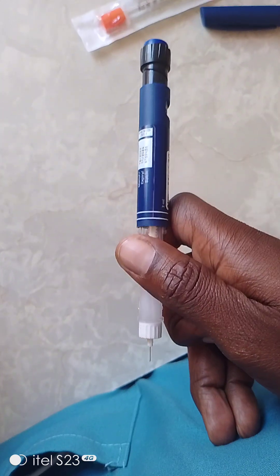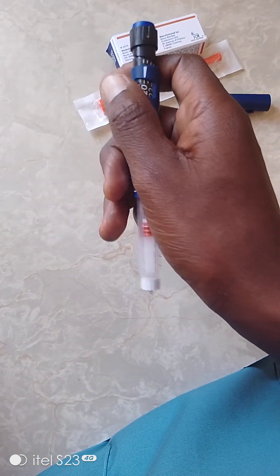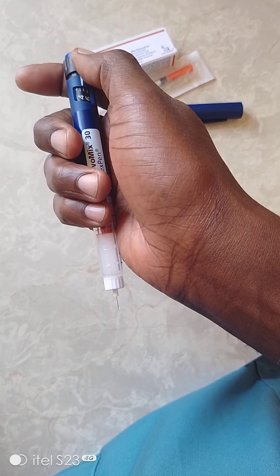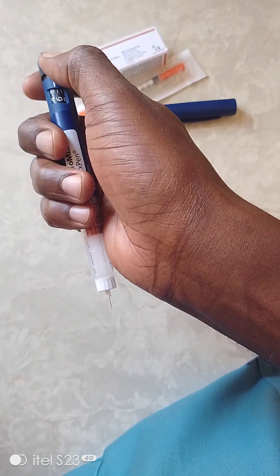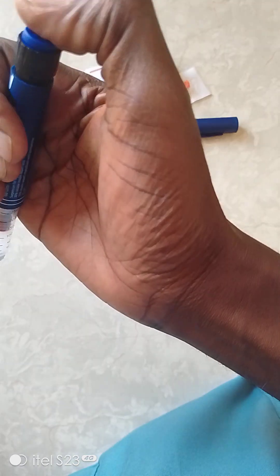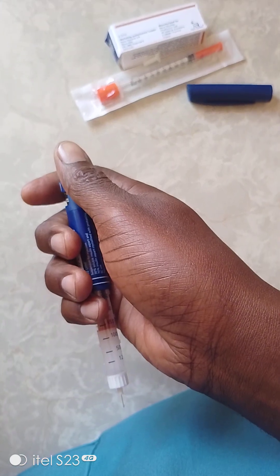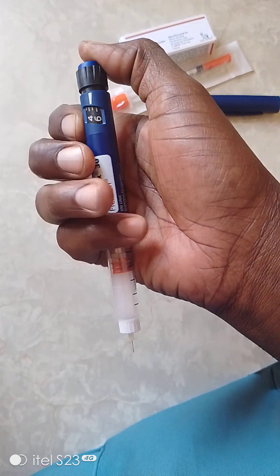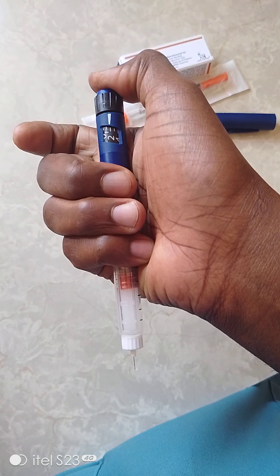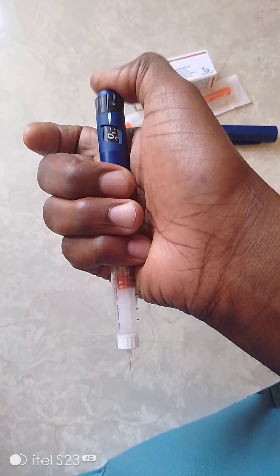For demonstration purposes, 20 units is too much, so let's reduce to something smaller - set it at six. You press here, this is more like a button. When you push it in, you prick - the needle goes straight into the subcut, then you start pushing. Check out the counter - the counter is reducing. You can see there are drops of insulin coming out.